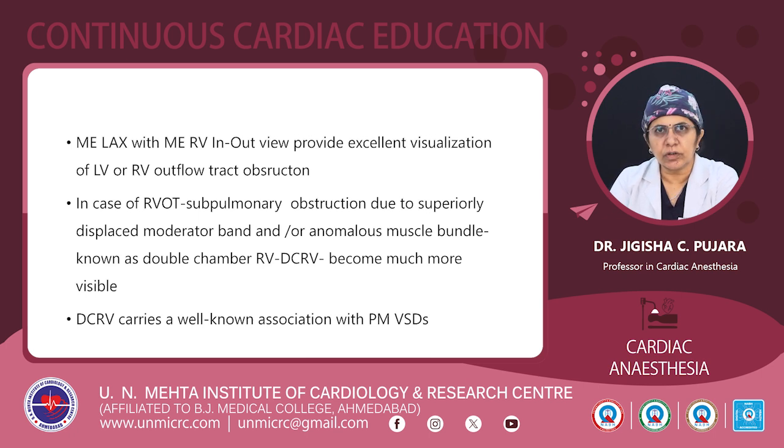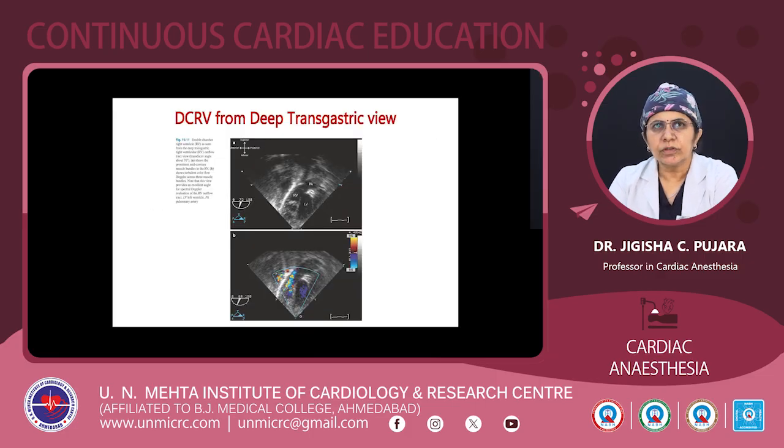DCRV carries a well-known association with the perimembranous VSD. So, when there is a perimembranous VSD, it is very important to look for the muscle bundle. DCRV one should address during surgery, otherwise the patient can have RVOT obstruction and a gradient across the RV outflow.